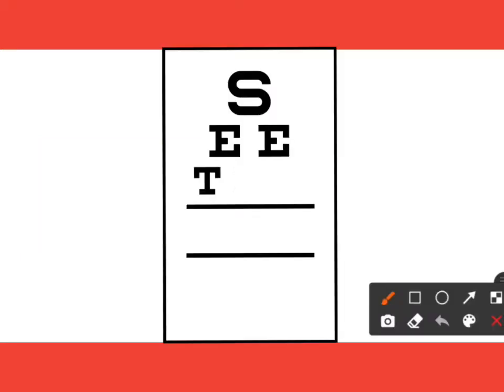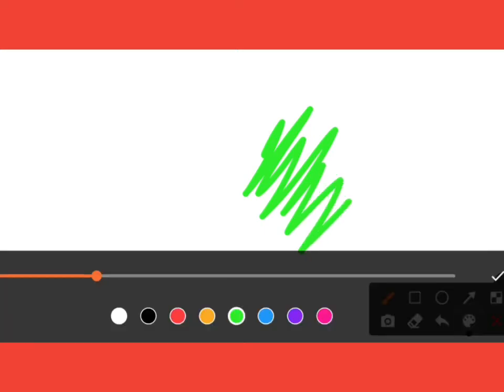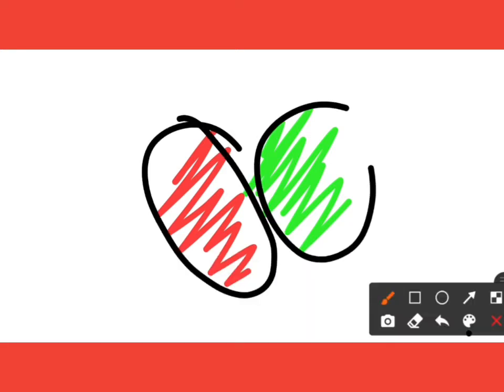Today in this video I'm going to discuss a very important topic that we all should know, that is the duochrome test. From this name we can easily understand that two colors are taking part. One is red and another is green. On this screen you can see this is red and this is green.